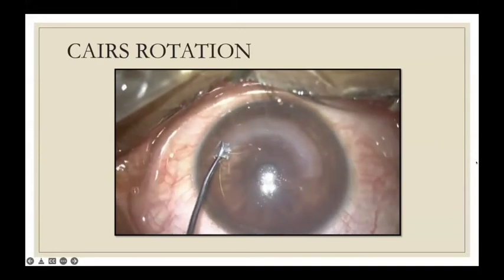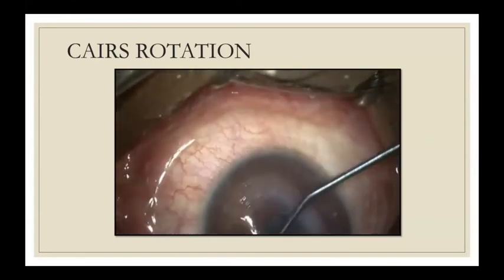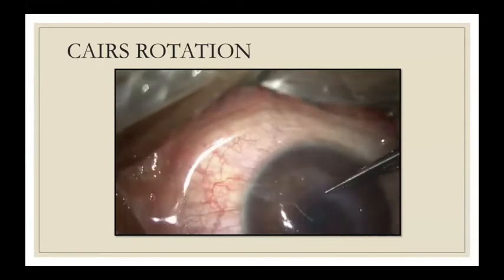So we wanted to rotate it in the post-operative period. You can see the adjustability of CAIRS. You can easily just push it forwards and then rotate it. It's just like a DSEK lenticule.